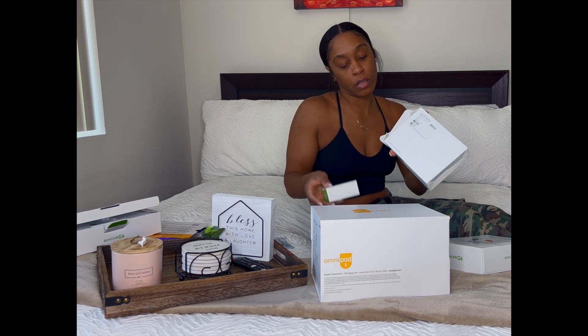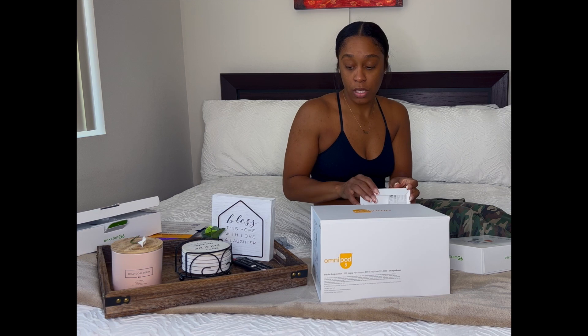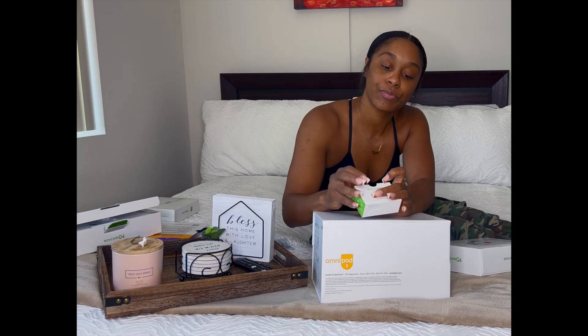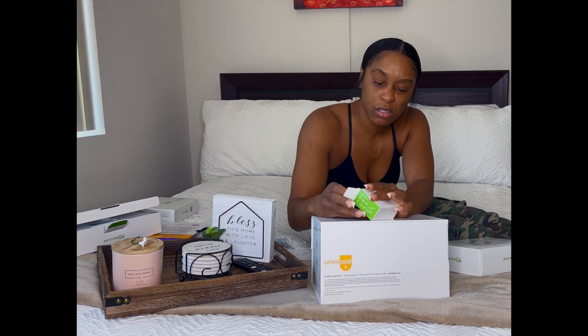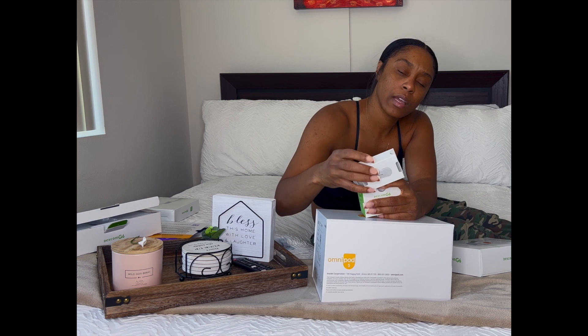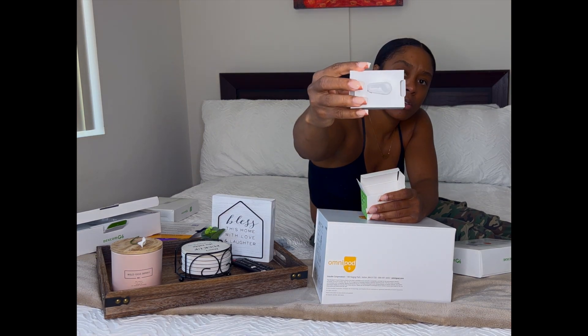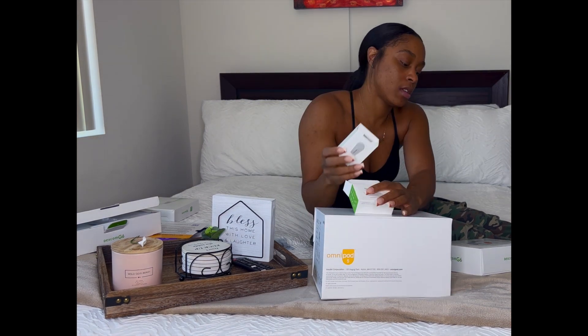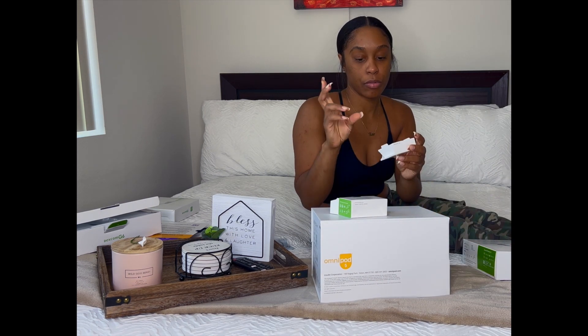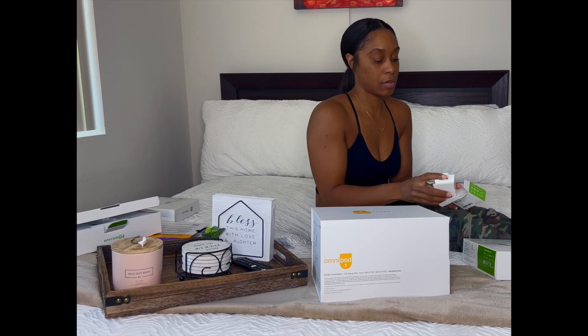I'm going to do a separate video where I actually put them on, so you guys can see the process. The transmitter comes in this small box — it's super tiny and this is what goes inside the sensor. It reads and transmits via Bluetooth.